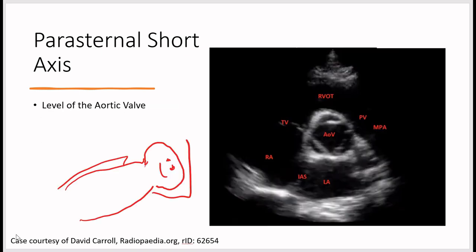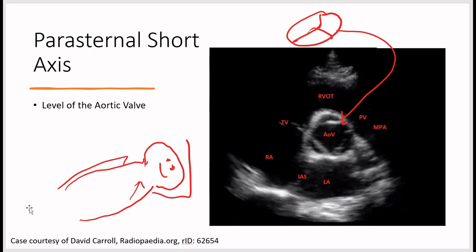For the parasternal short axis at the level of the aortic valve, drop the tail of the probe so the beam points toward the base of the heart. You'll see a Mercedes sign where the aortic valve is closed. Structures visible include the RV outflow tract, tricuspid valve, right atrium, inter-atrial septum, left atrium, pulmonary valve, and the main pulmonary artery.